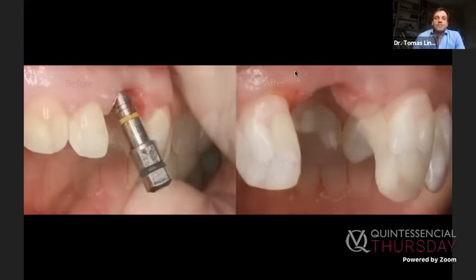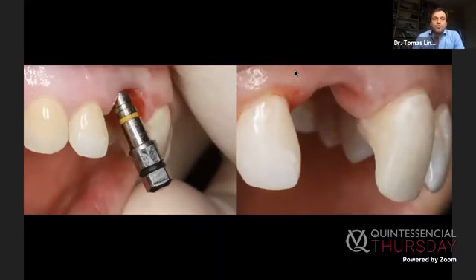So of course, now I understand that this was not quite true in the majority of the cases, because here we can see this was a malpositioned implant and nothing you can do here prosthetically, in my point of view, because the position is bad, and just by removing it, we already see how it improved.